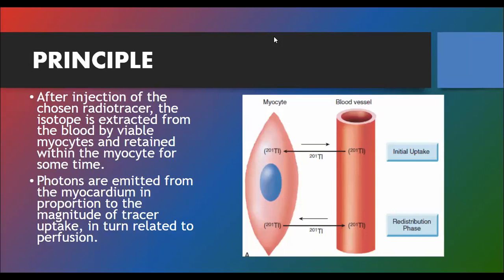Recapping it, the basic mechanism of this whole myocardial scanning process is going to be dependent upon the isotope and the uptake. We commonly inject the technetium isotope into the bloodstream. This isotope is absorbed by the myocardial cells of the heart. If the myocardium is diseased, blood flow will be less, so lesser isotope is delivered to the cells.